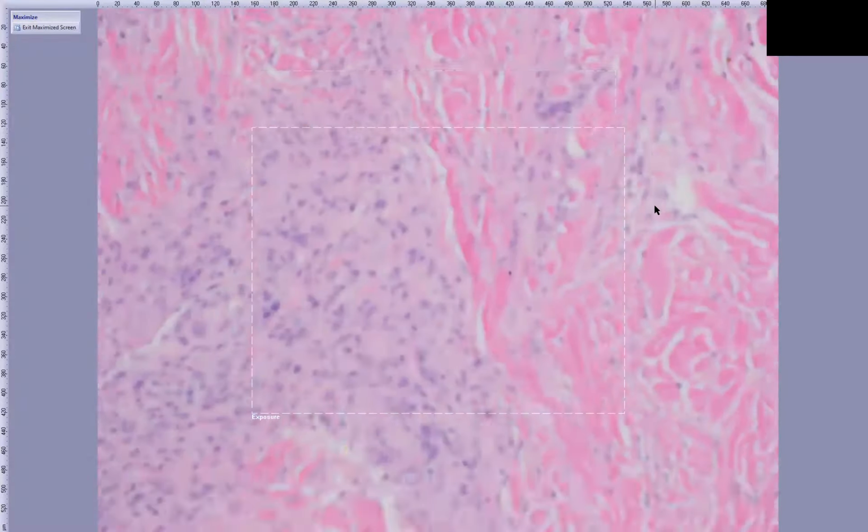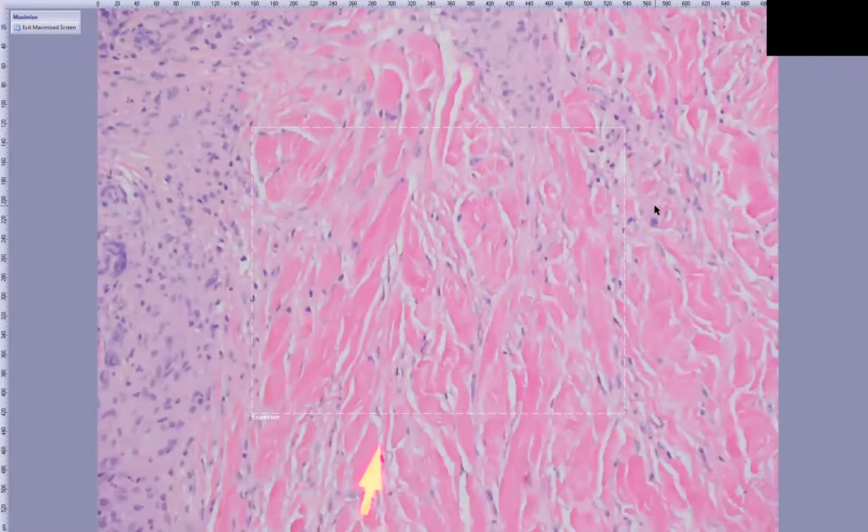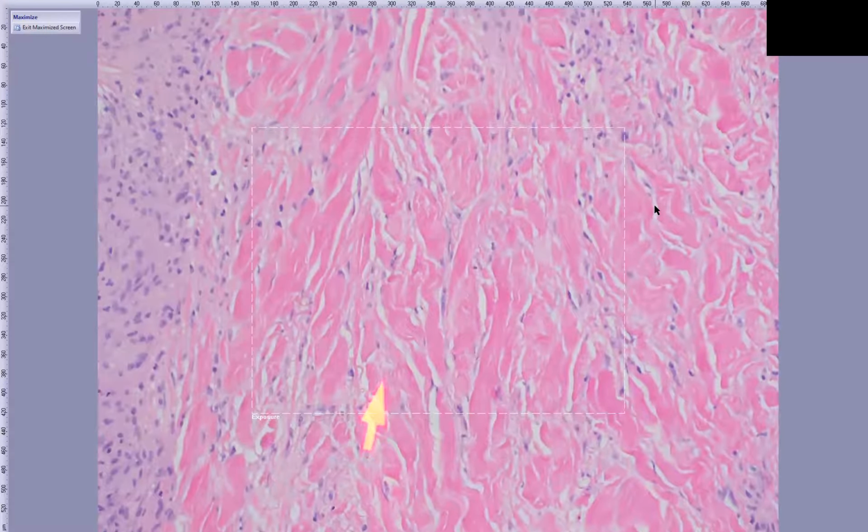And you do have these zones of relative paucicellular infiltrates that allow you to contrast them from the other areas that are more densely cellular with epithelioid histiocytes. So while NXG has more clearly defined zones of collagen necrobiosis with cholesterol clefts, it's a little bit more subtle with necrobiosis lipoidica. And you obviously don't have cholesterol clefts in necrobiosis lipoidica.